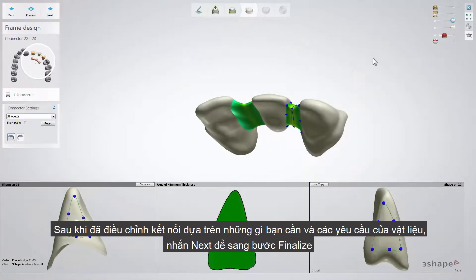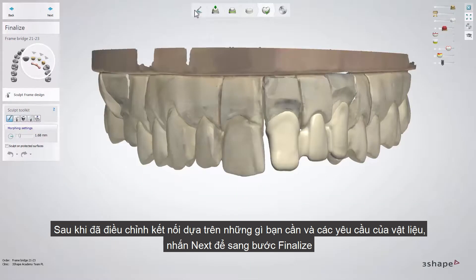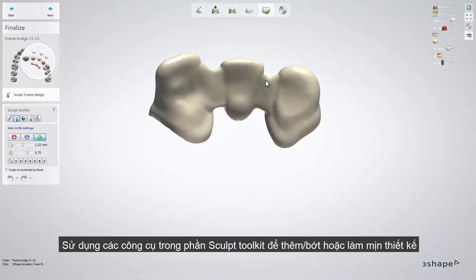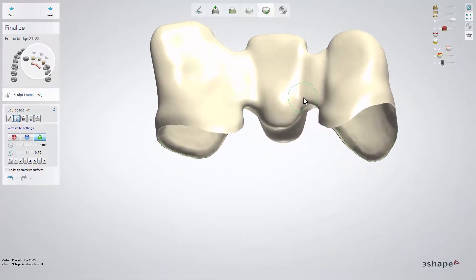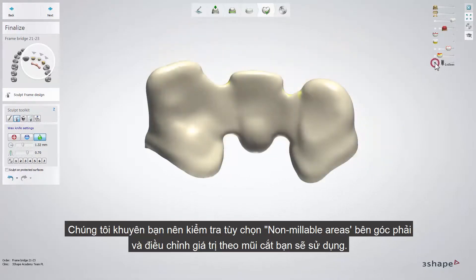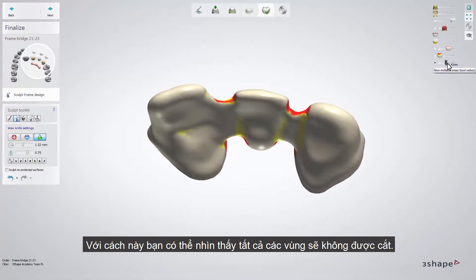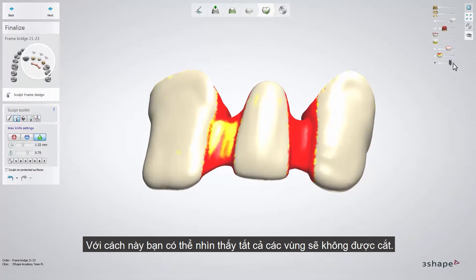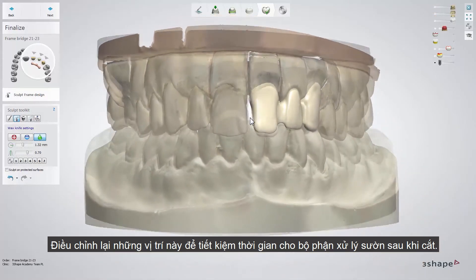Once the connectors are set according to your wish and material requirements, click Next to get to the finalized step. Use the tools from the Sculpt Toolkit for the Add, Remove function or to smooth your design. We recommend checking the non-millable areas option in the visualization sliders and setting its value according to the size of the tools you are going to use. That way you are able to see all the areas which won't be milled with a certain bur size during the manufacturing process. Smoothing those areas at this point definitely saves time for the lab technician during manual processing.